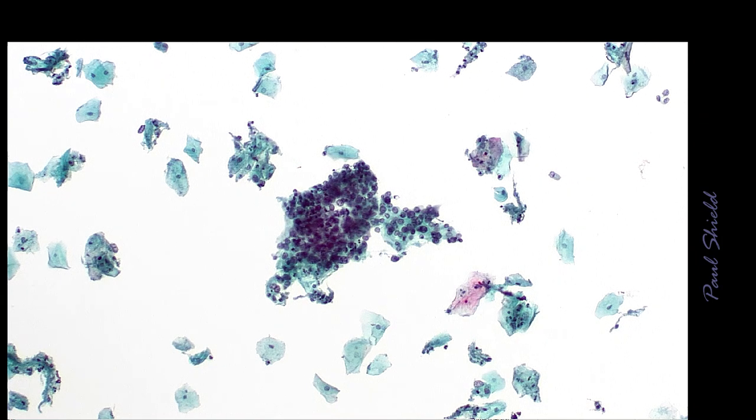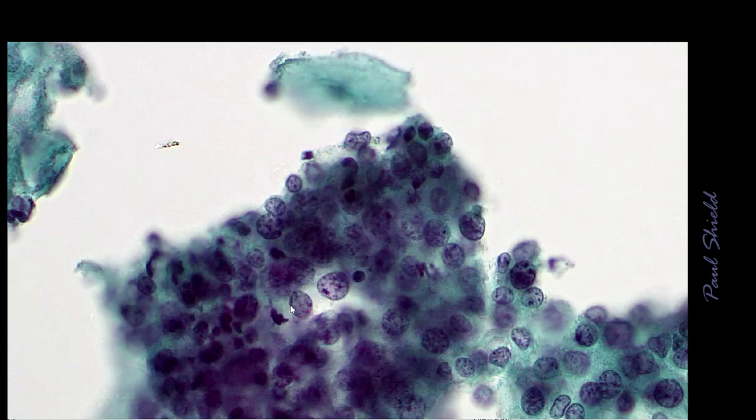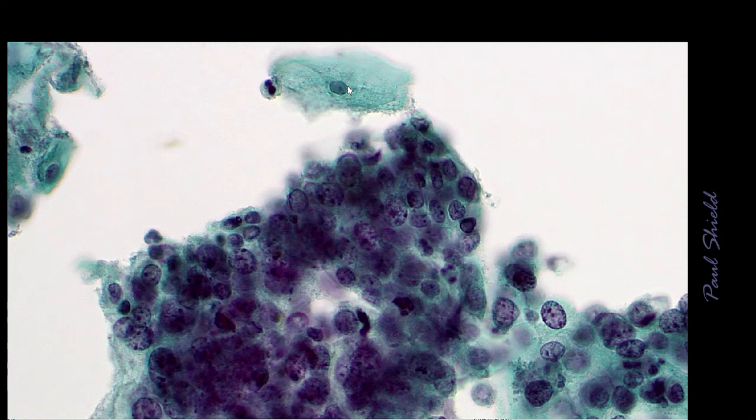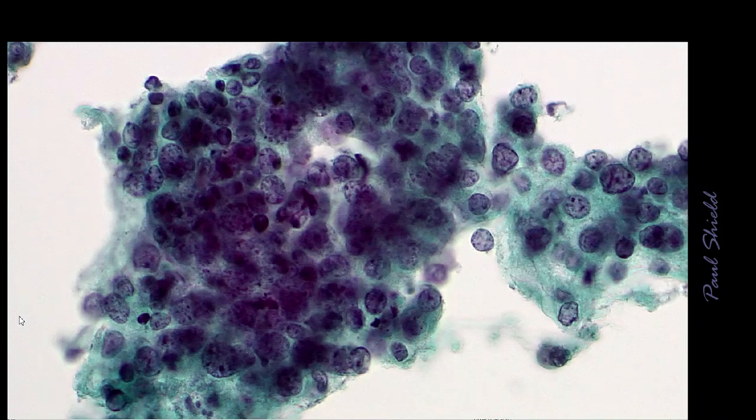Same case, this is a bigger group next to those endos. And you can see even at low power, it's not looking endocervical. So the nuclei are not in focus at once. There's another intermediate. They're quite large. They're much darker. This is probably a few nuclei deep if I focus up and down.